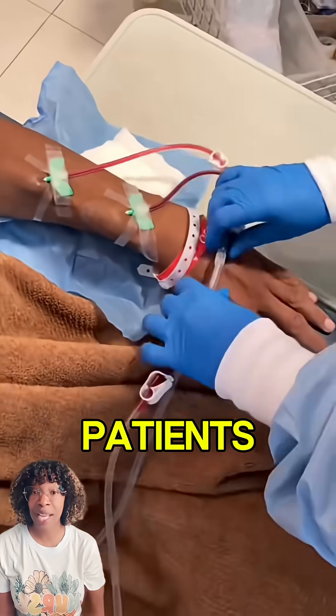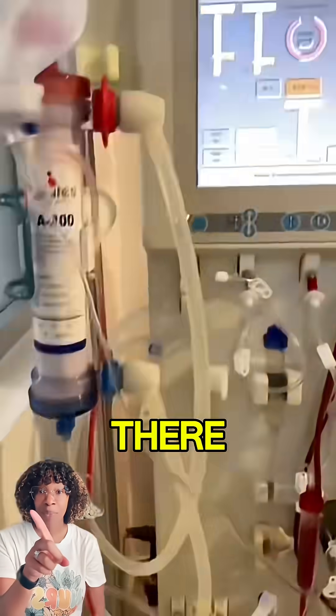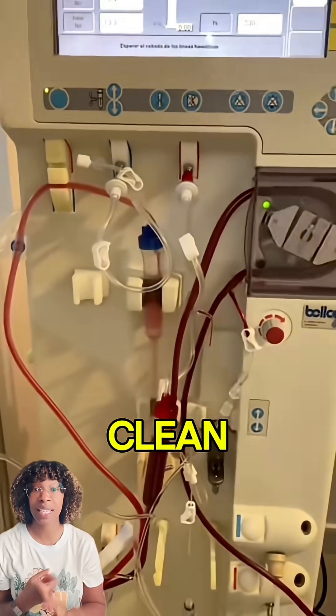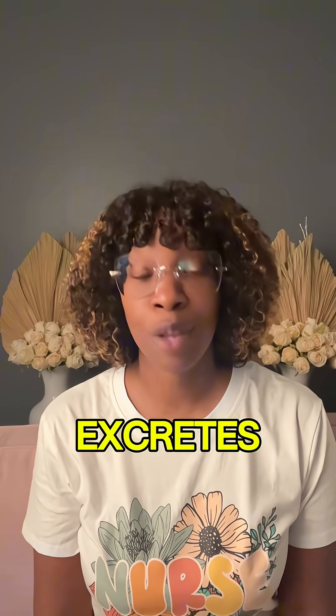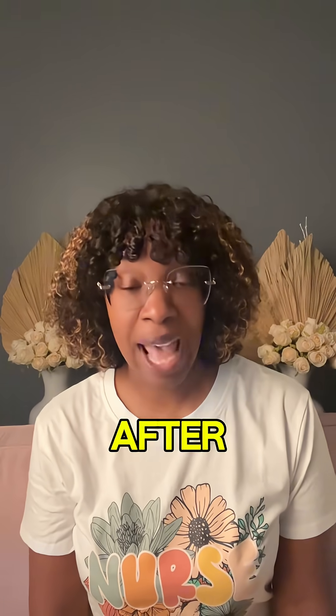But remember, for dialysis patients, that machine is their lifeline. That right there is their kidney — this machine right here cleans their blood. The dialysis machine also excretes fluid from your body. That's why the patient is weighed before treatment and after treatment.